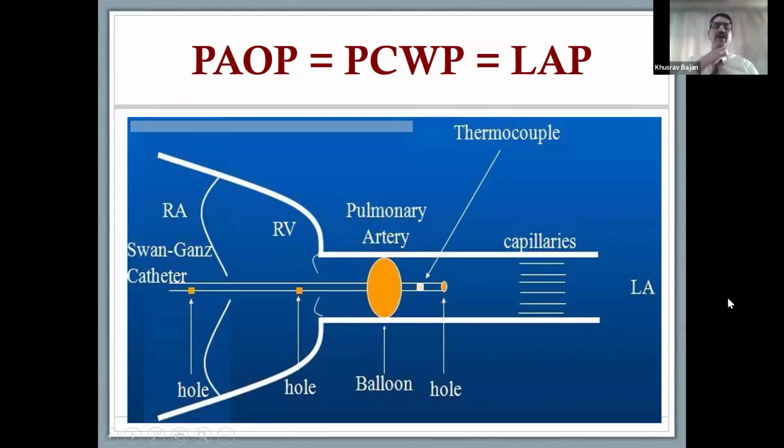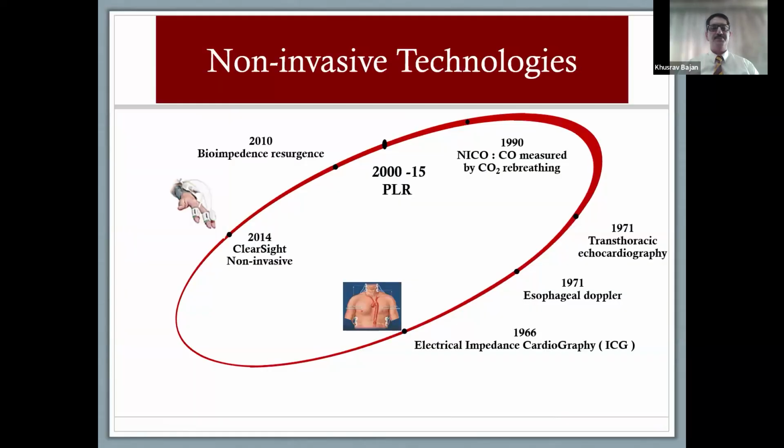So whenever there is a right ventricular dysfunction, a PA catheter might be useful. Across the updates and literature, for the last 15 years, people have stopped using PA catheters because they say the mortality is higher. So you might be called an outdated intensivist or emergency physician if you are using a PA catheter, but believe me, there are still a load of indications where it can be used. And the PA catheter actually taught us not only the hemodynamics, but even the tissue parameters of hemodynamics.